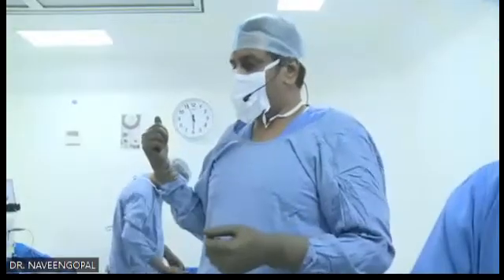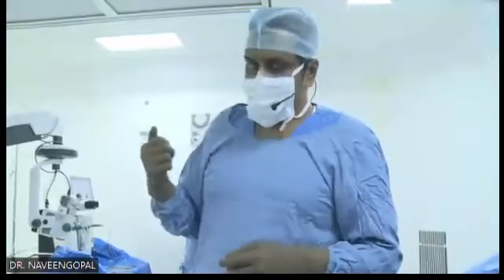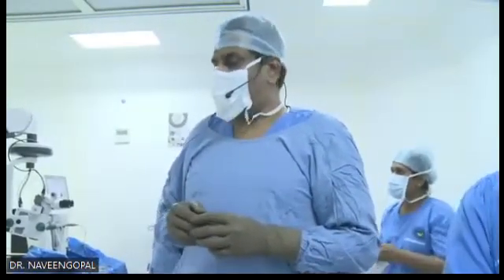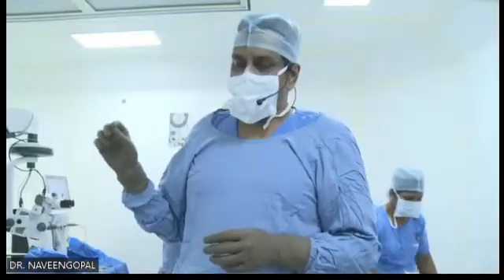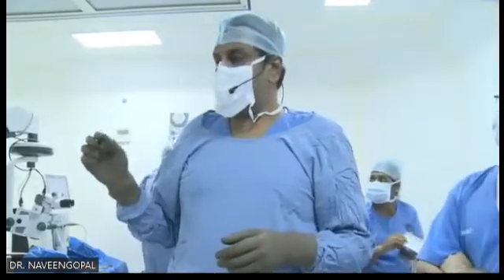Any other thing you want me to ask? Is the complaint bad enough to remove it? No, I tell them it will settle down. I have never removed an ICL. I don't think you have also removed one, Dr. Raghu. No, I have never removed an ICL till now because of the glare.